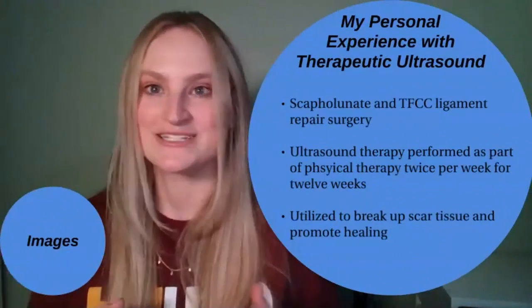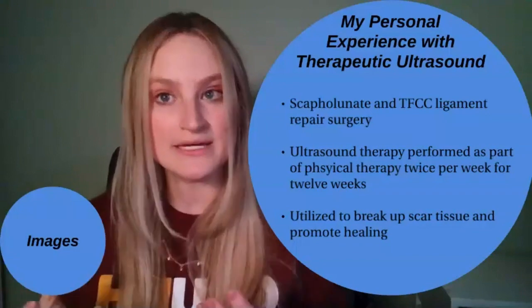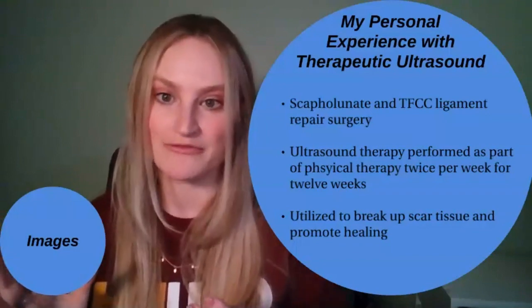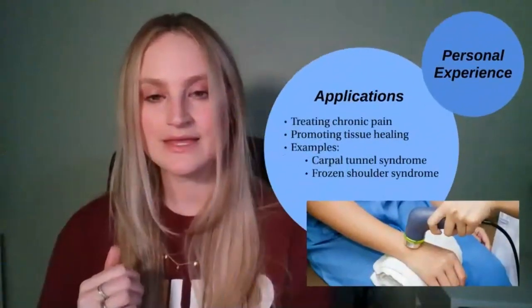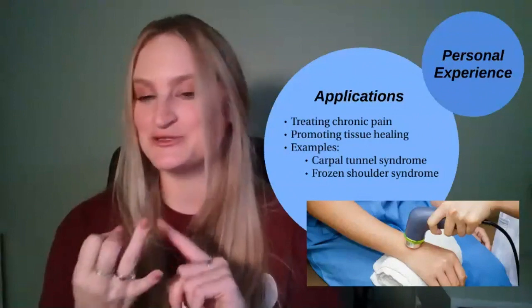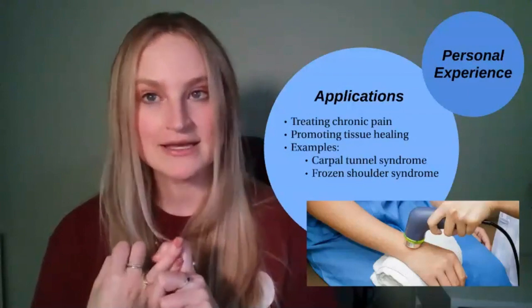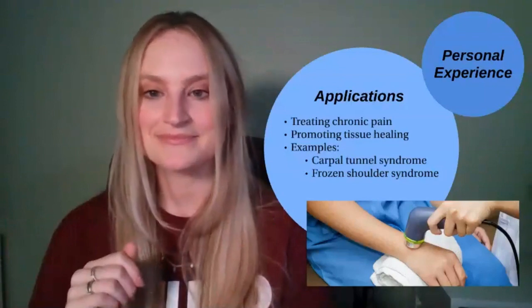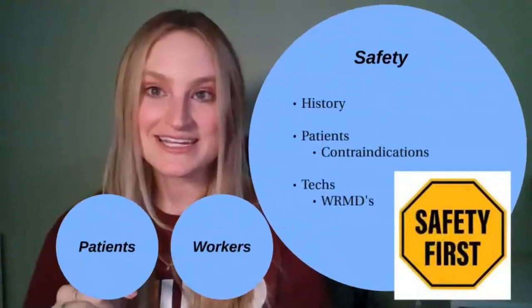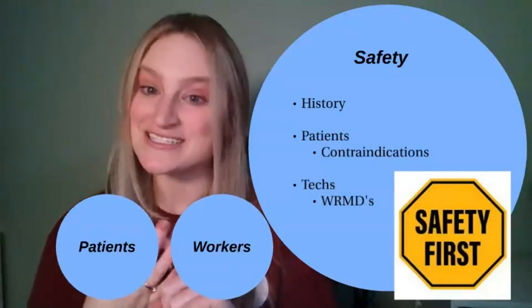I know I am not the only person to have benefited from therapeutic ultrasound. The treatment itself is very common, with millions of therapy sessions being performed each year. From musculoskeletal to neurological, from soft tissue injuries to chronic arthritis, therapeutic ultrasound applications abound. Right, now we will briefly discuss the history of ultrasound therapy, then patient safety and therapist safety.